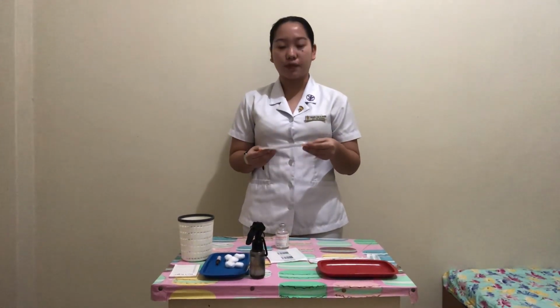And if the syringe is capped, remove the cap first because we'll have to connect the insulin syringe to the aspirating needle.